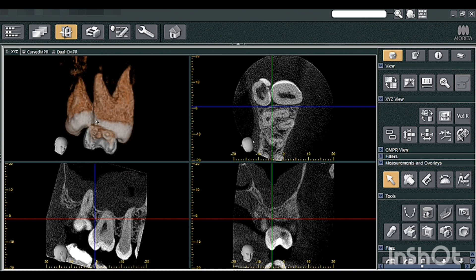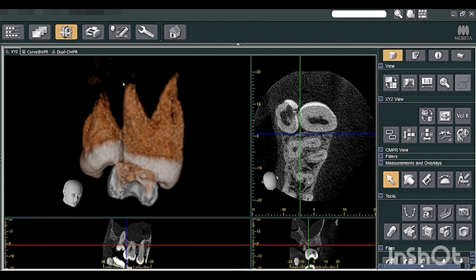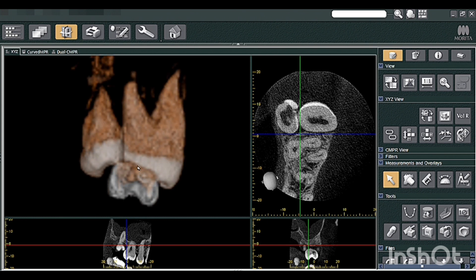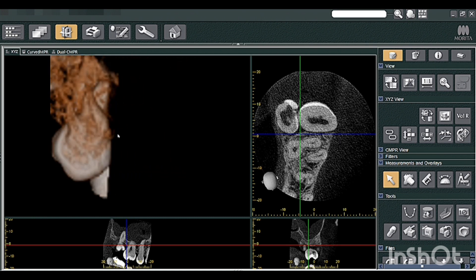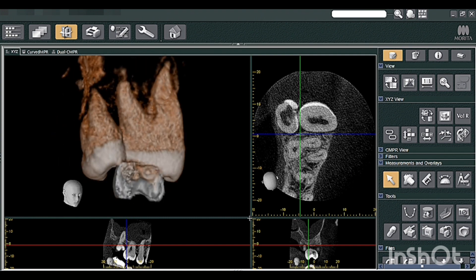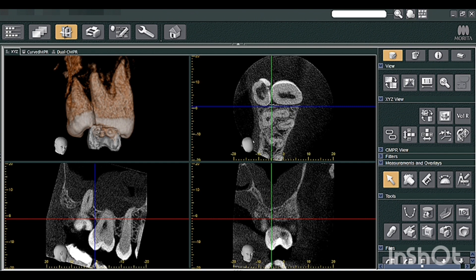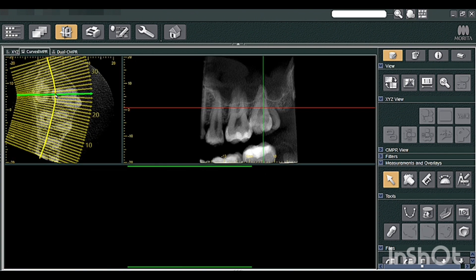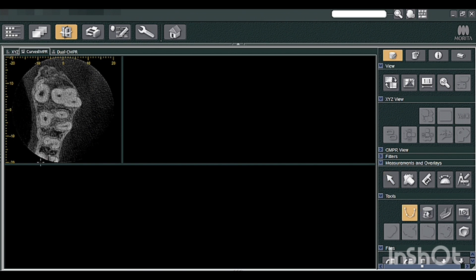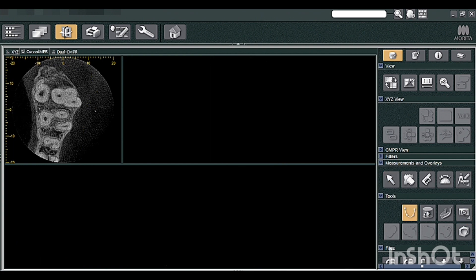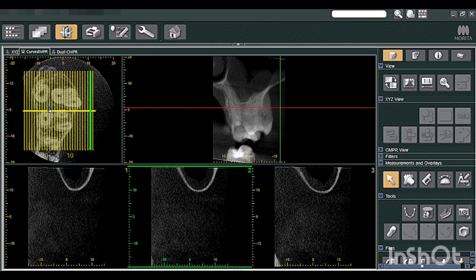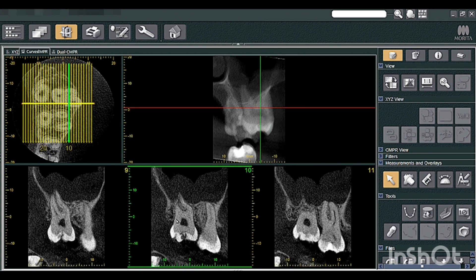This is how the tooth looks. Both are separate from each other — there is no case of fusion or gemination. It's just a separate tooth; the position of 28 is palatally placed and a little away from its original position. The root anatomy appears to be fused roots of 28. You can check the same thing in sagittal sections. Delete the current line markings and mark them from buccal to palatal instead.